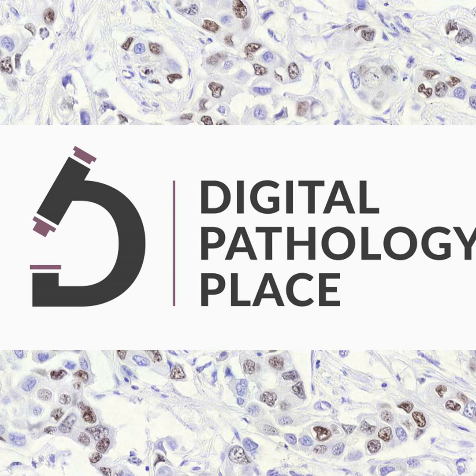Further institutional adoption came in 2001 when the U.S. Army telemedicine program started utilizing dynamic telepathology, demonstrating the practical and strategic value of this technology. By 2005, they transitioned from using static images for consults to whole slide images, highlighting the rapid evolution and acceptance of this technology.